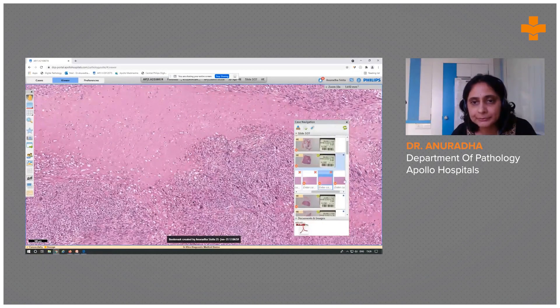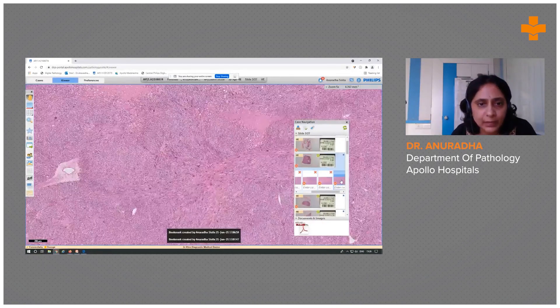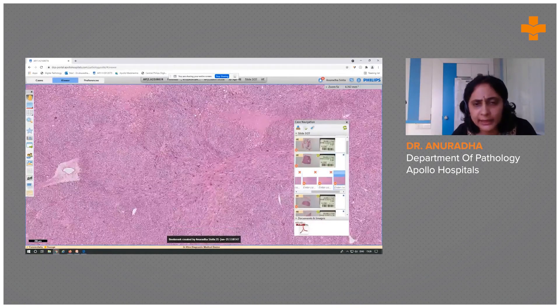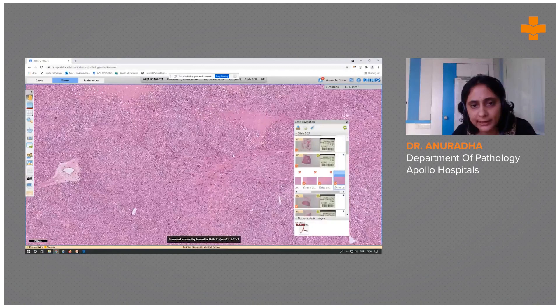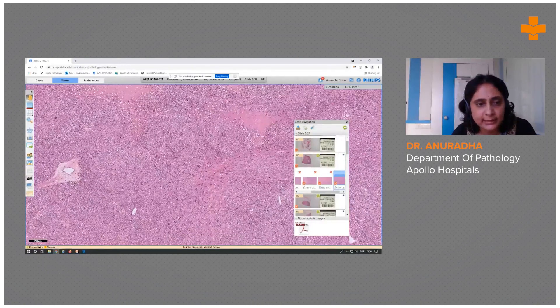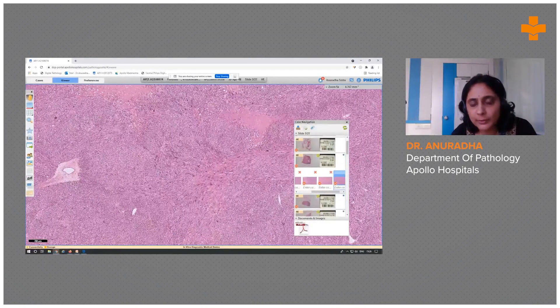Another area showing the necrosis and the fascicular arrangement of the tumor cells. It was uniformly composed of spindle cells.